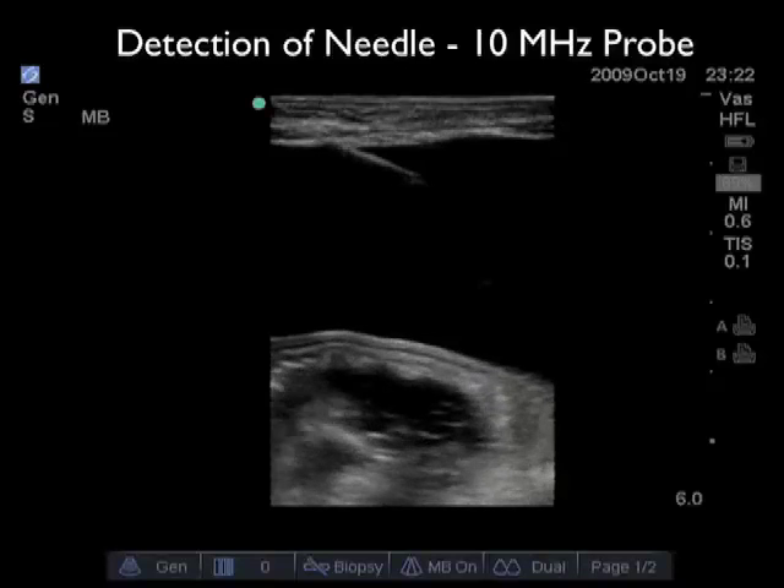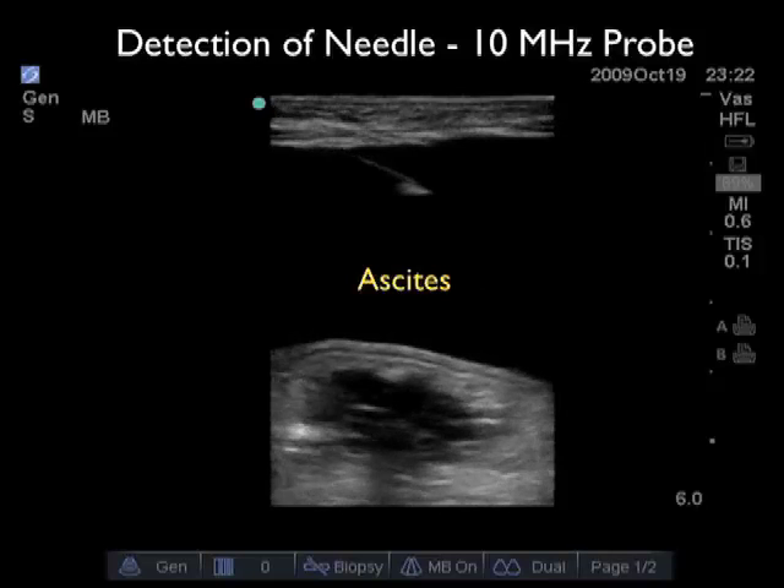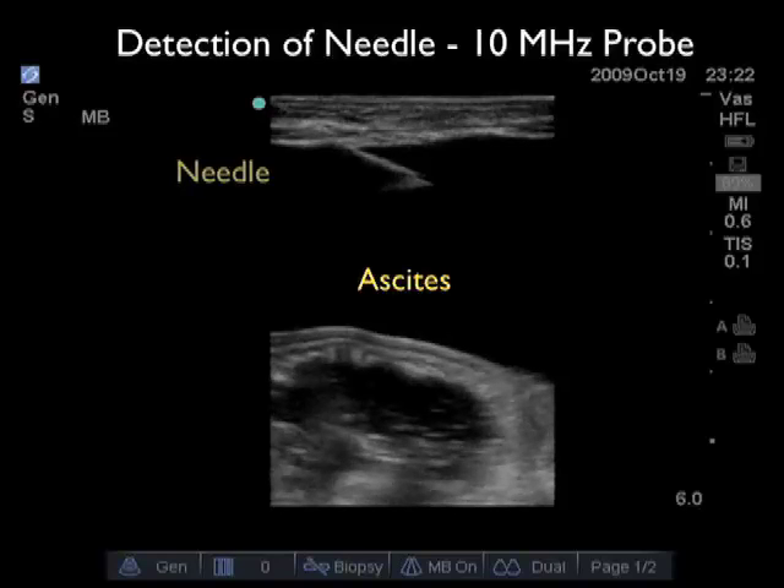In this video clip we can see how using the higher frequency 10 megahertz probe allows real-time guidance of the needle down into the ascites pocket. We see the needle coming in from left to right through the abdominal wall with the tip safely parked within the ascites fluid. Notice that the bowel is distant to the tip of the needle, thereby minimizing any puncture through the bowel during the paracentesis procedure. We need to put a sterile sheath over the probe during this procedure.